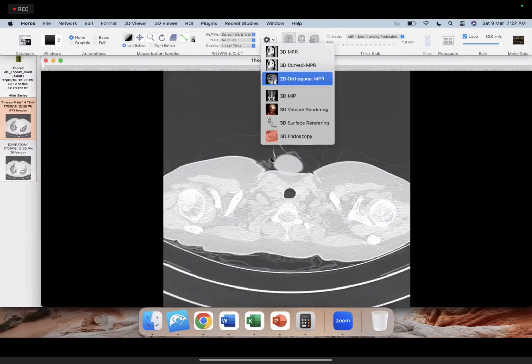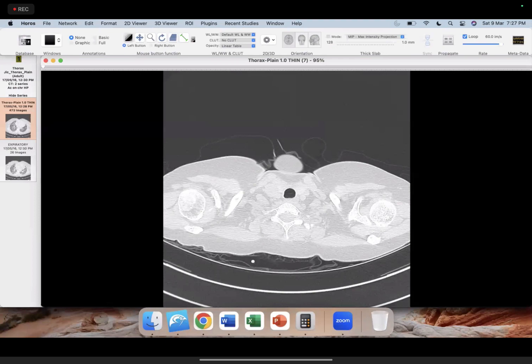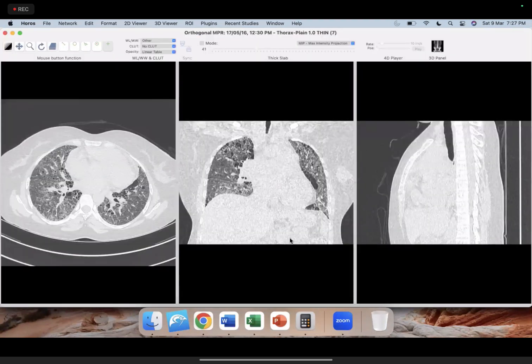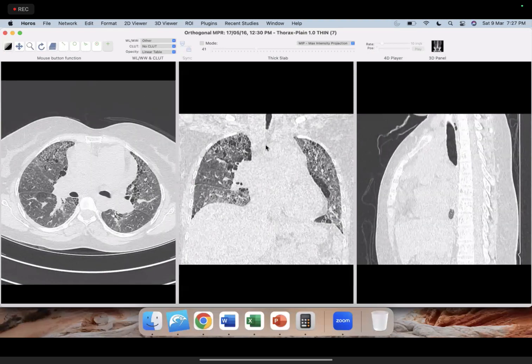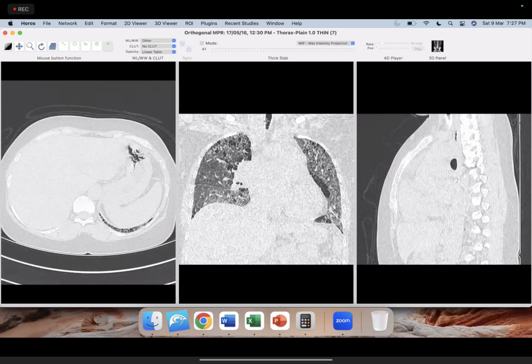Again, I hope the scan is now visible in my Osiris viewer in 3D, right? Okay, can you see, just one time? Can anybody say yes? Then I know that this is switching properly. Okay, good. Thank you. So let's see this case.